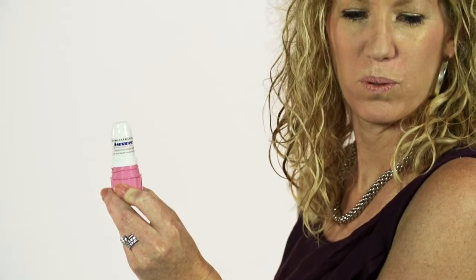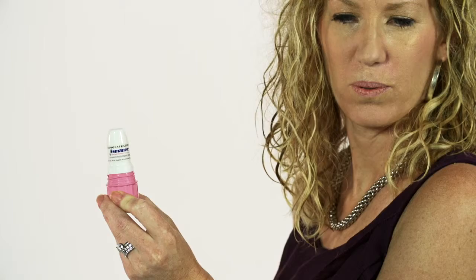Exhale away from the Twisthaler. Be sure not to blow into the Twisthaler so none of the dose is lost.